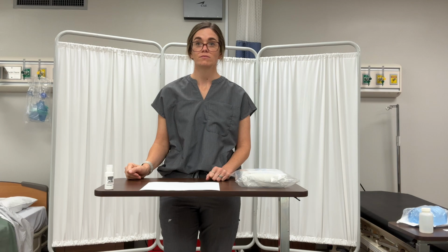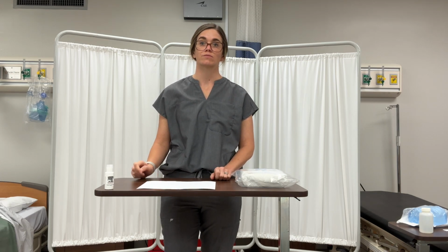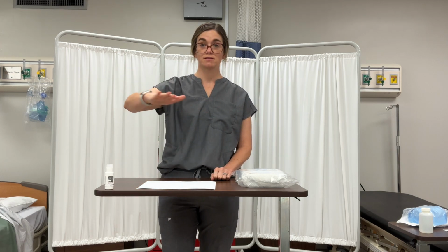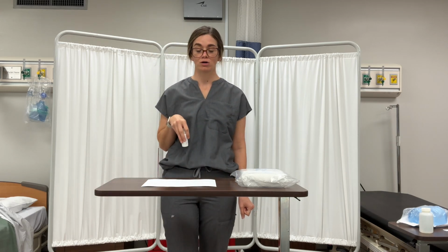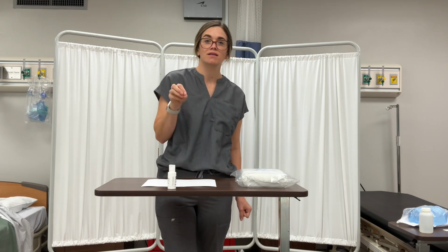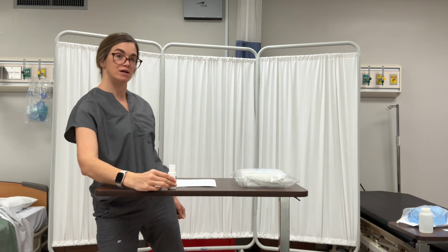Movement around or in the sterile field must not compromise or contaminate the field. So you can't reach over like this, because that's contaminating. If I have something over here I need to get, I am not going to go like this. That is wrong. If I reach over, I'm contaminating. There's particles on my hand that I could be sprinkling on my sterile field. I'm going to reach around.